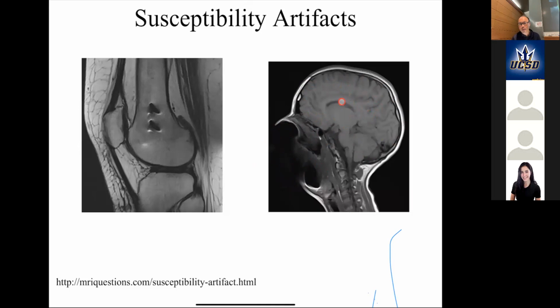So the question is, wouldn't metal in braces be ripped out at extreme velocity from an MRI? Luckily, generally not, because they don't have that much mass and they're pretty tightly in there. But it's generally not a good idea to go into an MRI machine with braces, simply because if something is a bit loose, it will become looser. Is it possible to induct them? Yes, that's also possible, and that's another reason not to go in, because it can actually induce current. And that's why we need to make sure.